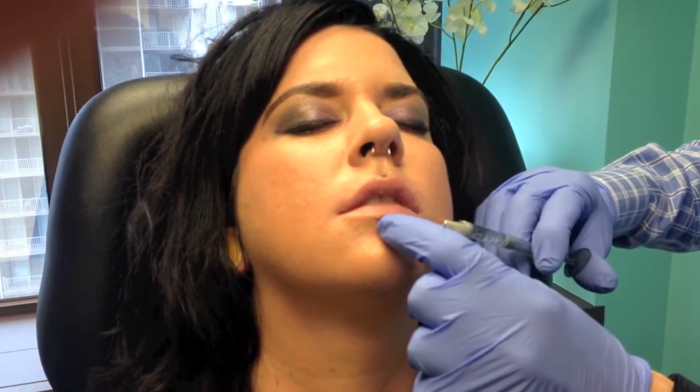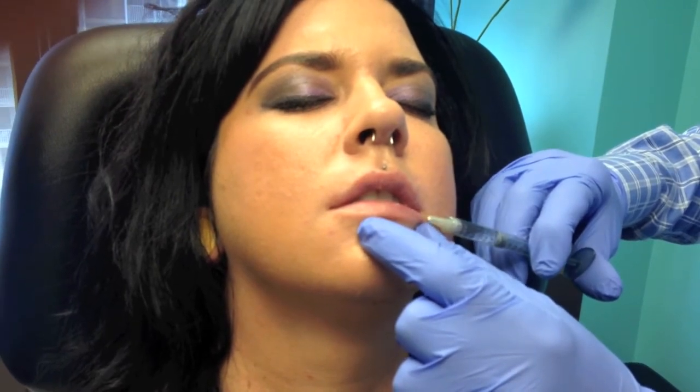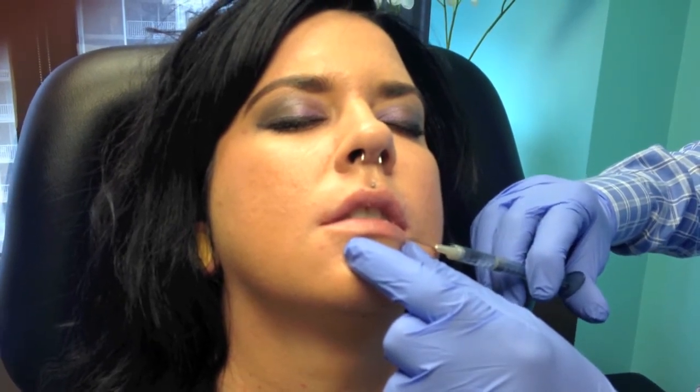We'll go a little bit to the lower lip to balance it out. Entry point, and slowly — you can see where the needle is, you can see right where the head of the needle is. It's anterograde as well as retrograde as I'm pulling out and also filling. There's the tiniest little bleeding — you just hold a little pressure and it stops and you don't get any major bruises. If you see the filler separate and fill up different layers, just massage it and it's as smooth as butter.